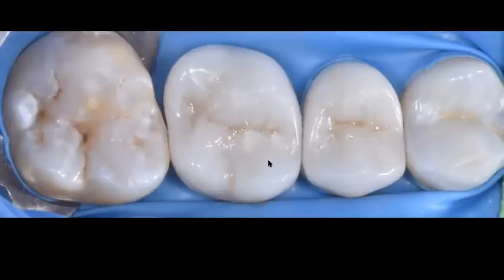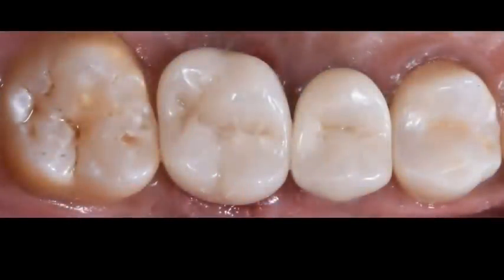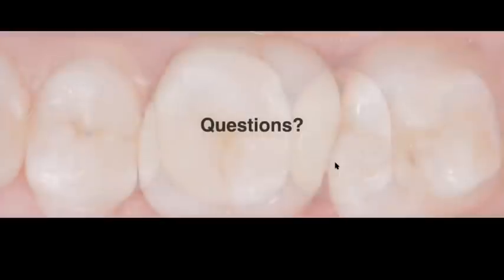But in this particular case, because this is a zirconia restoration and this is a very opaque material, as we all know, I'm only going to use dentin throughout. So I'm using a little bit more dentin, and I'm creating both the buccal and the lingual inclines. And I did the same over here for the posterior tooth, for the molar. And then I just adjust the occlusion and polish. And this is the final view of both restorations after I've completed my access hole sealing using composite resin.